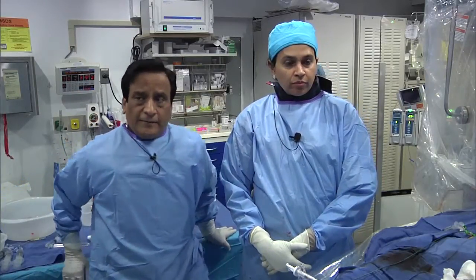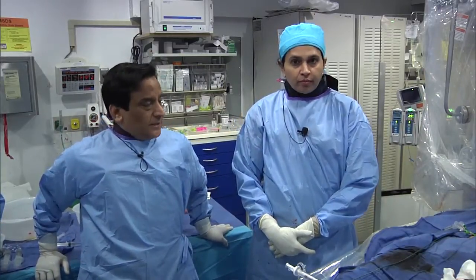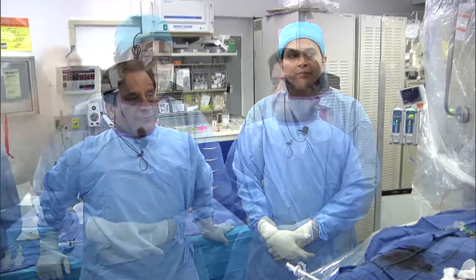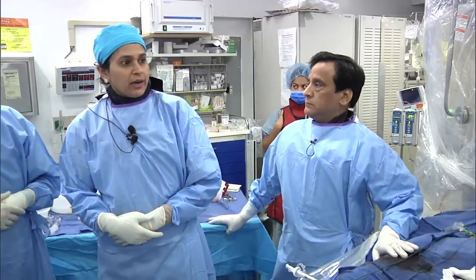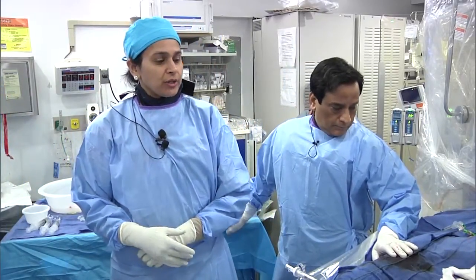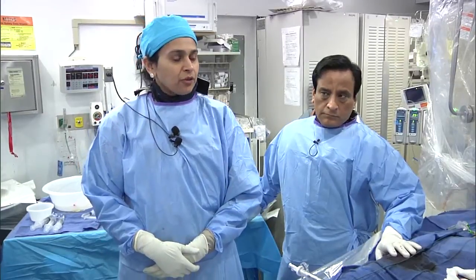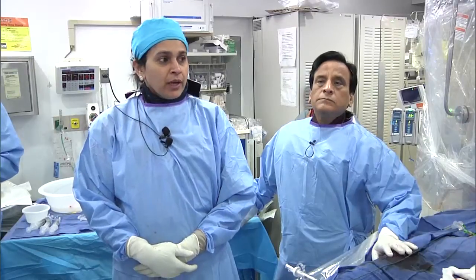And it was a great case. Practical tips: trying not to create extensive dissection was the key. Anu, was it the mother and child approach which did everything here? Your question was whether the Guideliner or mother-child helped in this case. Yes, we showed in the demonstration that the 1.2 balloon reached the CTO area and we were not able to advance it further. And of course, the Guideliner helped us to get it further and cross the lesion.